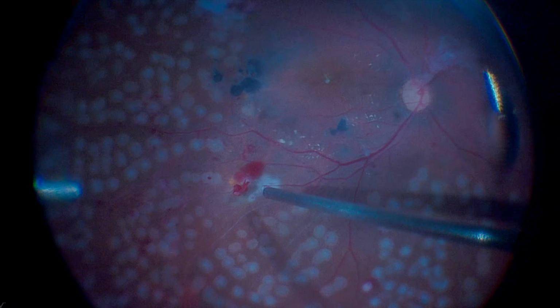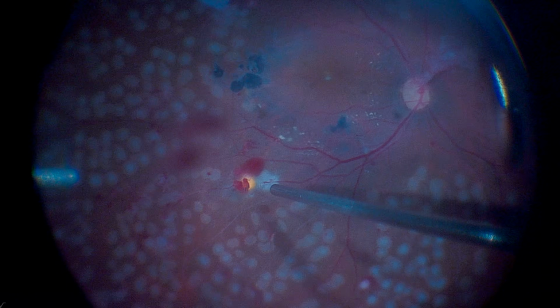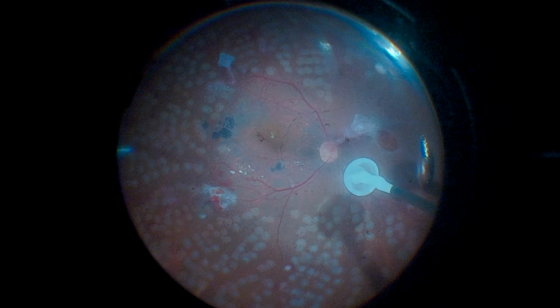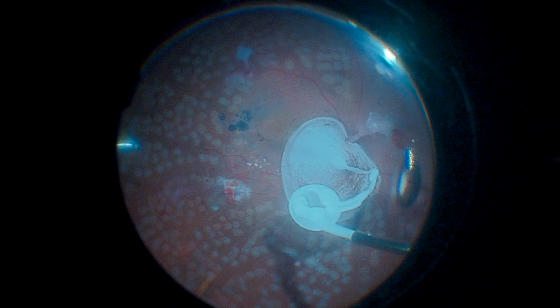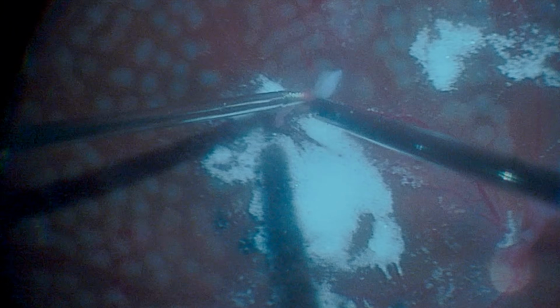We can use the endolaser in continuous mode to achieve adequate hemostasis of the bleeding points. Triamcinolone can be used both as a dye and as an adjunct for retinal hemostasis. Then, the vascularized pedicle in the inferior temporal arcade is grasped with a retinal forceps and cauterized with endocautery, preventing bleeding during the reduction of fibrovascular tissue.